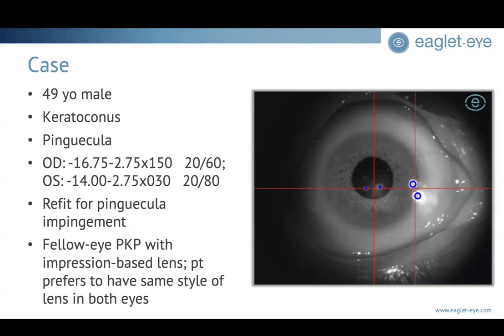And he, with a very high prescription with his keratoconus, came in recently to be refit in the right eye, or asked to be refit. We made the team decision that we're going to put him in something different because he had a lens that was performing fairly well on the right eye, a commercially fit lens, non-impression driven. But again, we have wonderful options on the market for fitting scleral lenses of all different fitting styles.